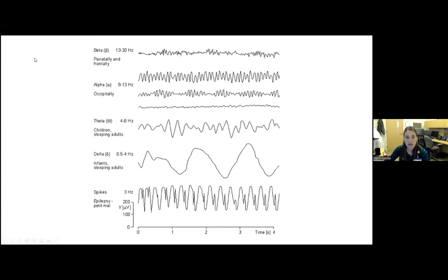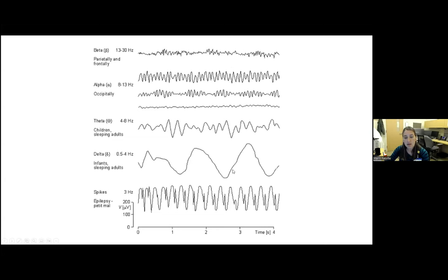To show examples of different wave types: beta waves are really fast activity, almost too fast to count. Alpha frequency is the nice normal awake pattern in the back of the brain. Then there are slower waves: theta range slowing, and even slower delta range waves. When I talk about spikes or sharps, we literally mean something that looks sharp and spiky - pokey and pointy. These sharp and spike waves are abnormal findings that we'll see more examples of.